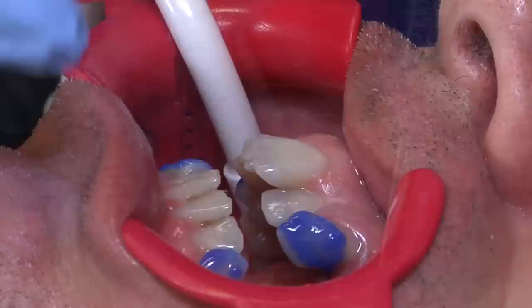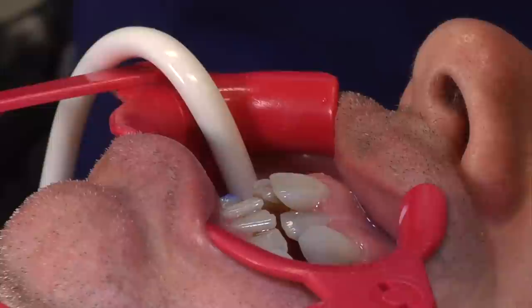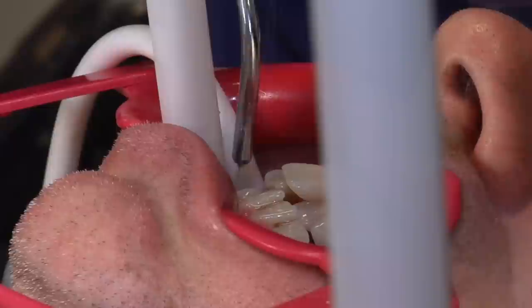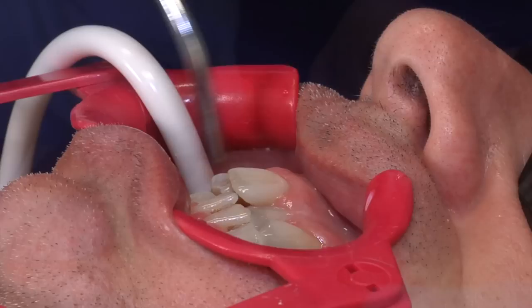Now that the gel has been sitting on the teeth, we're going to rinse it off with water. Once all the gel has been rinsed off, we want to make sure the teeth are nice and dry. From this point forward, we want to keep them nice and dry, so I'm going to blow air everywhere on the tooth.